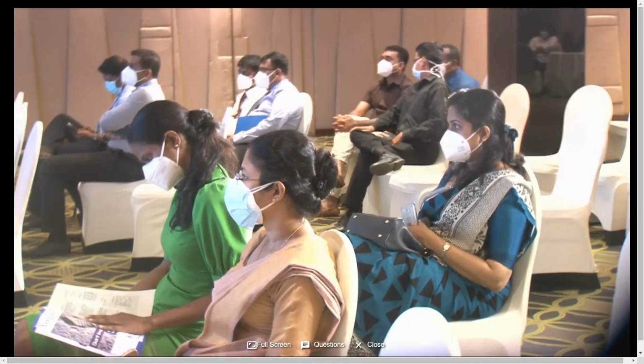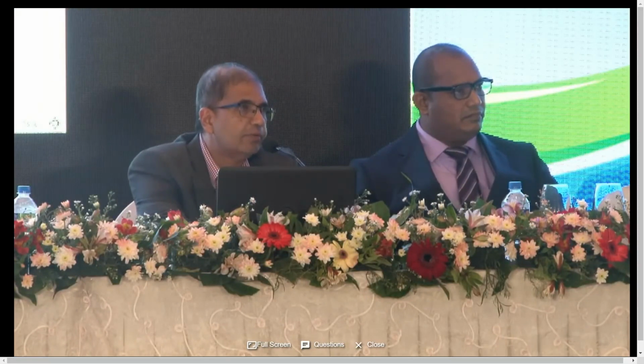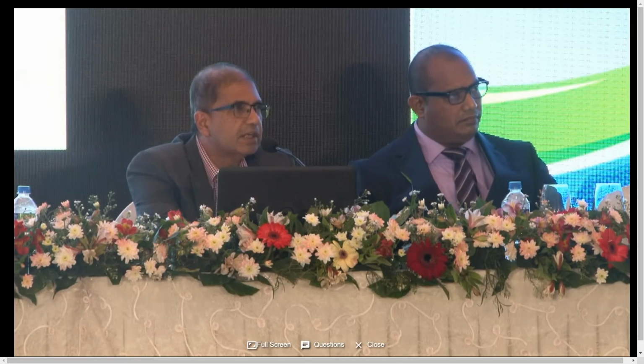Can you just let us know, Dr. Narasimhan, one of the things that we worry about when we try to do epicardial ablation is that we might injure the heart as we go in. Like, for instance, because sometimes the RV wall is very thin. Is there any kind of way we know whether we are actually entering the myocardium rather than the space? Any kind of... Thank you very much.